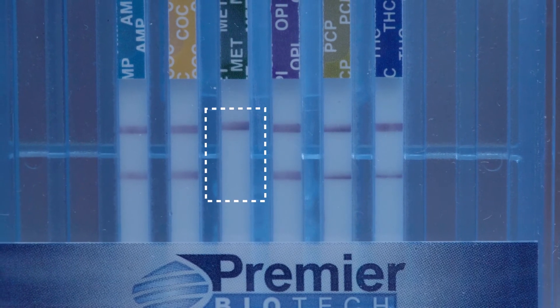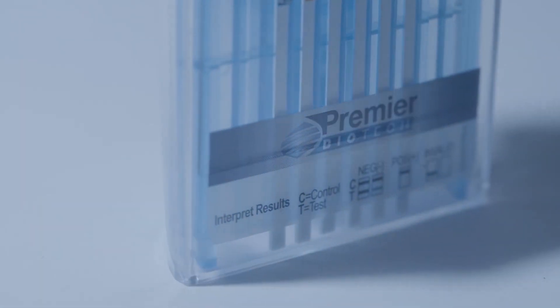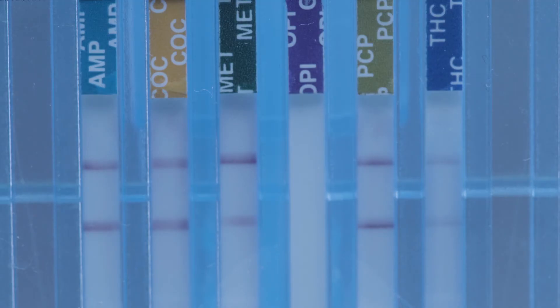Be sure not to read presumptive positive results until 10 minutes. Rarely, a device may have test strips that do not perform as intended. If after three minutes any test strips are not running, air bubbles may be inhibiting the migration of oral fluid up the strip. Gently tap the device on a flat surface.